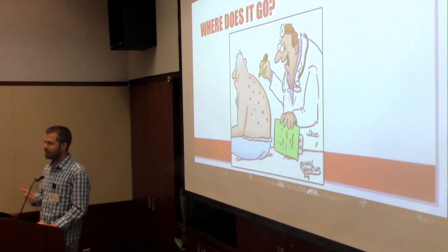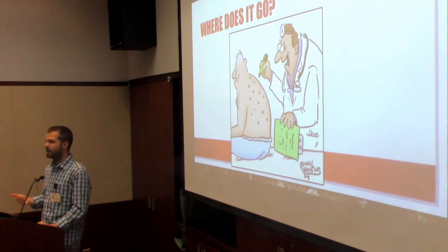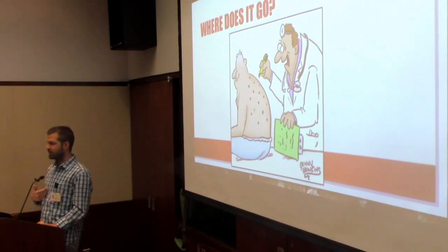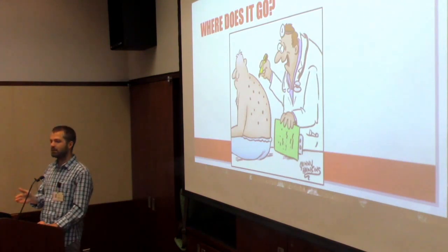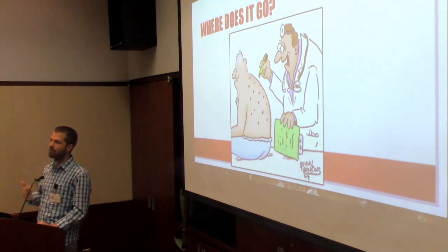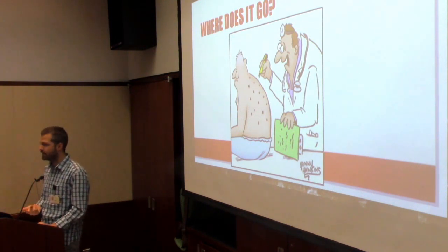The other thing to think about is left versus right. Doesn't matter in some things, but with a central line in the IJ, it may matter because it's a straight shot down versus having to loop around and you may end up in the arm. Those things are more obvious, but a lot of people have contraindications, and if they're out of it, they may not be able to tell you. So go looking for fistulas, look for other reasons why you would or wouldn't pick a certain side.